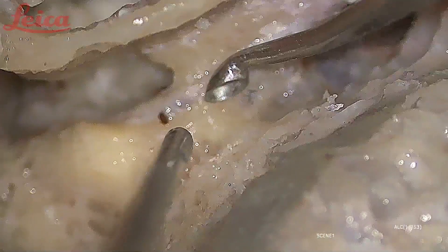Never drill the nerve through and through — always try to make the bone thin and then use blunt instruments like a curet or a side knife.